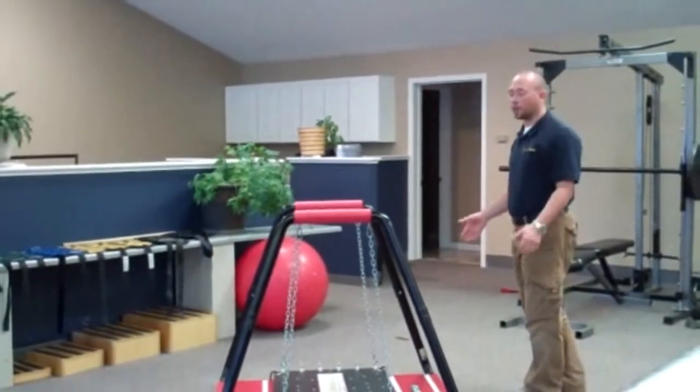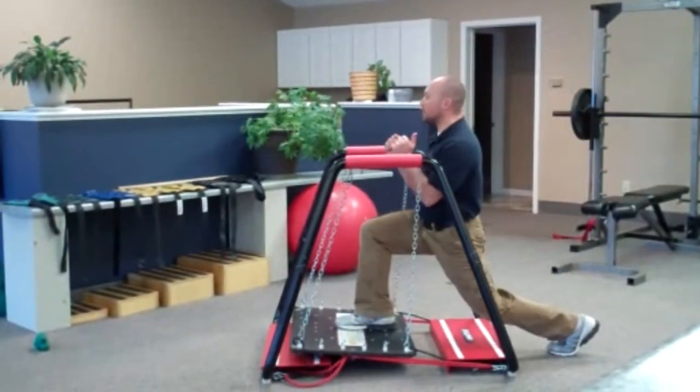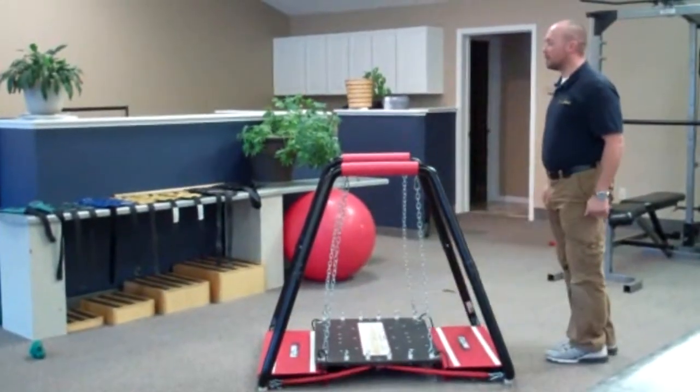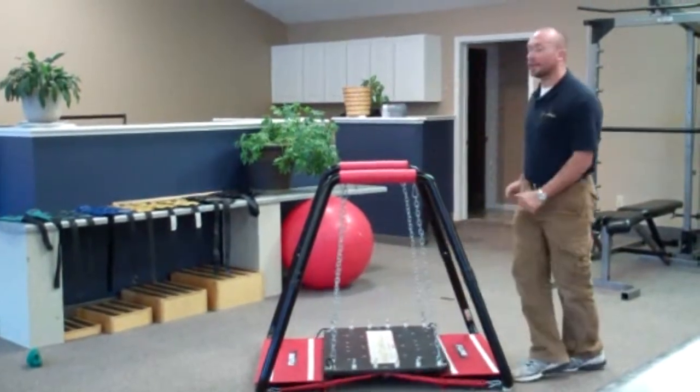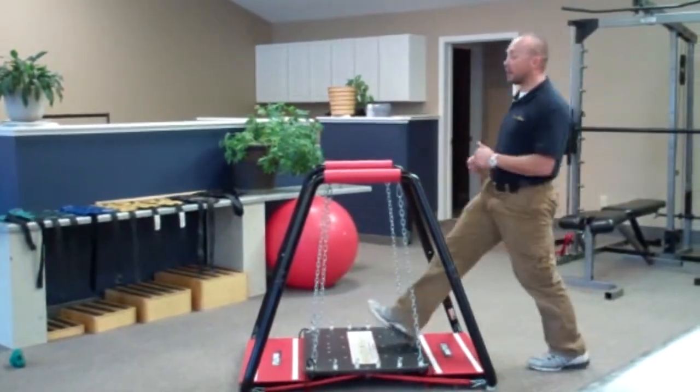The first one being the forward lunge. You want to make sure that the patient maintains good form. Their knee does not travel over their toe. If you can, get them to try and keep their back leg straight.